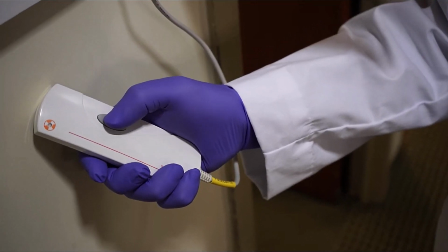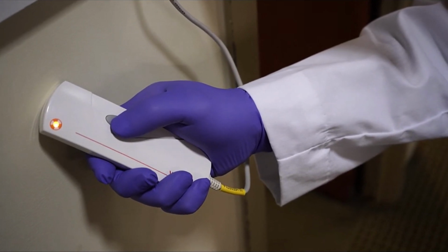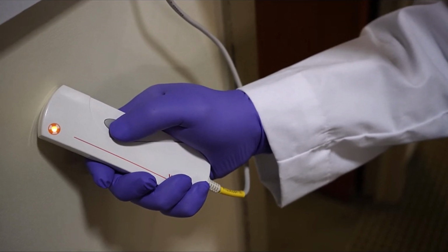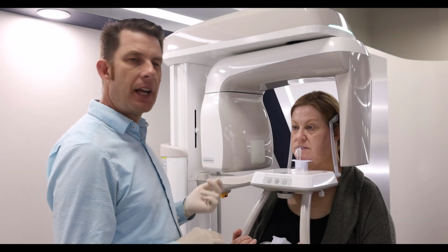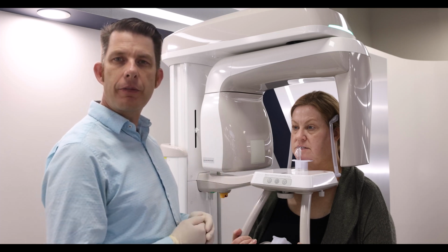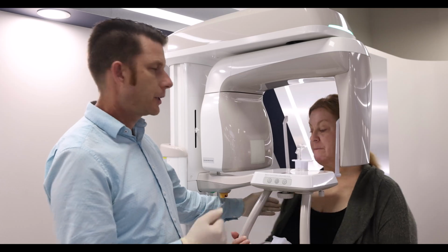The exposure switch allows the operator to control the image acquisition process from outside the X-ray room. Press and hold the button down until the acquisition is fully complete. The light on the switch will turn yellow when image is exposing. Premature release of exposure switch will abort image acquisition. Image capturing is complete. Once the image capture is complete and the overhead stops rotating, I can release our patient from the device. I'm going to open our temple supports and our patient can take a step out and be released.